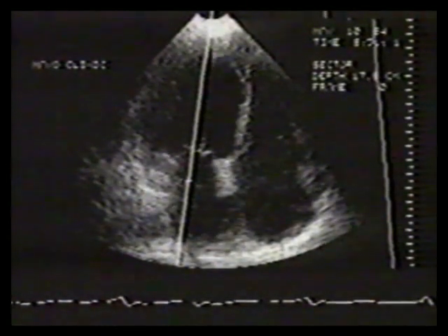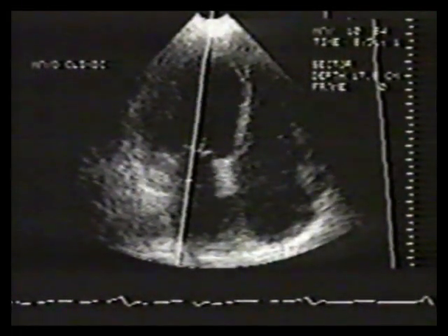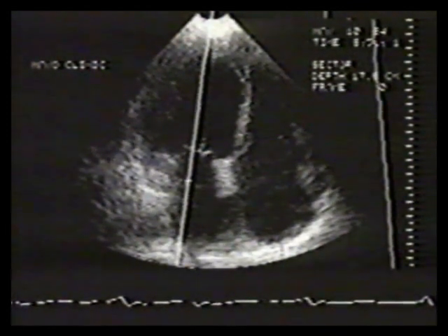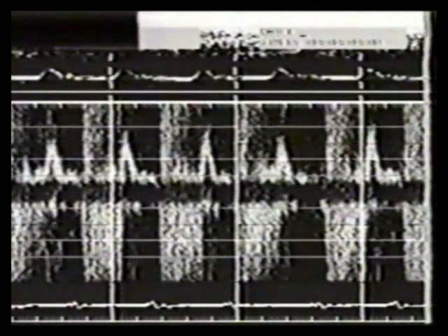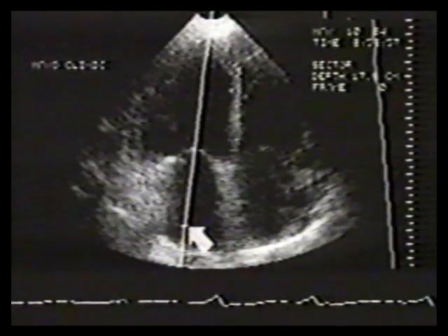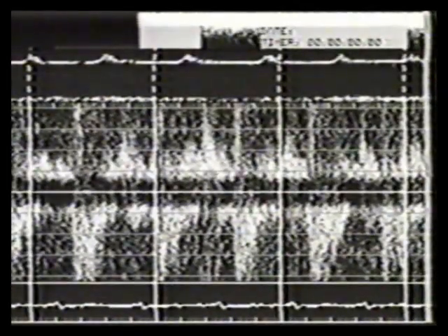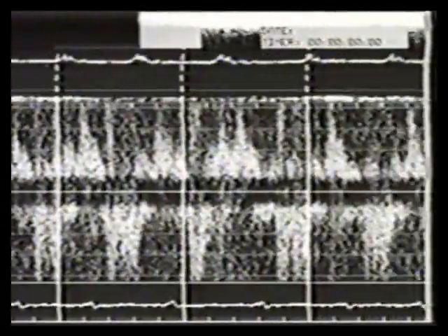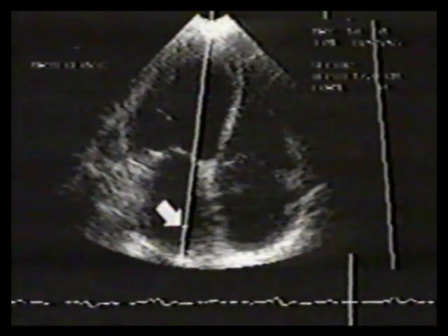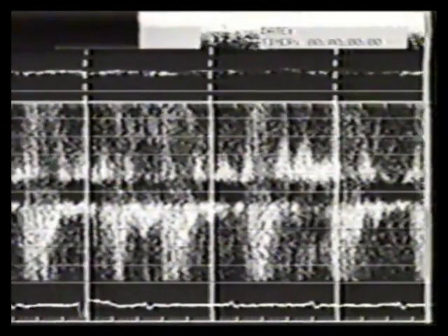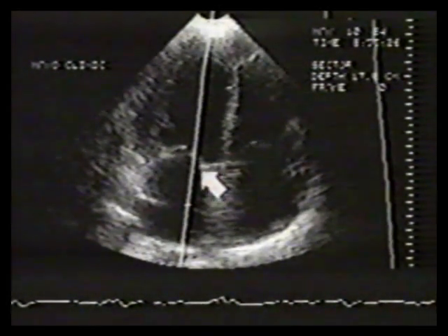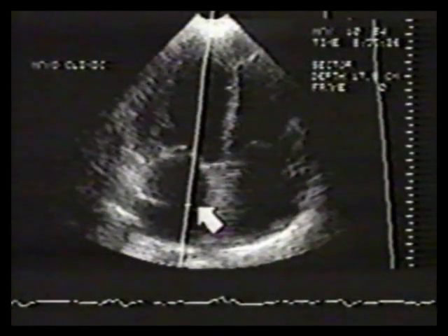The degree of mitral regurgitation is proportional to the extent to which regurgitant signals fill the left atrium. Therefore, we map the left atrium by placing the sample volume in multiple positions. Moving further into the left atrium, moving to the posterolateral wall, and mapping medially all show persistent regurgitant signals. In this case, mitral regurgitation was detected in all sampling positions, indicating severe regurgitation.